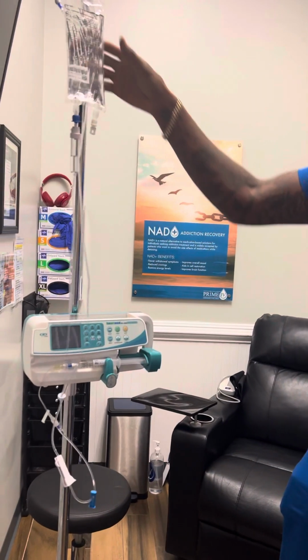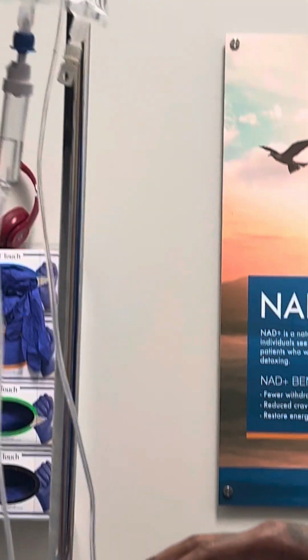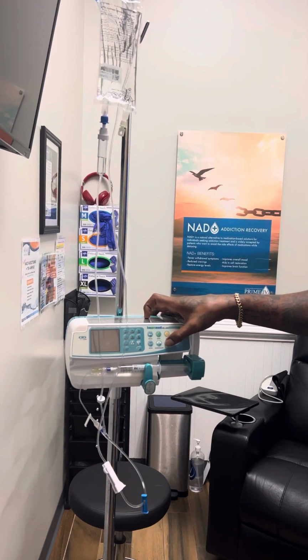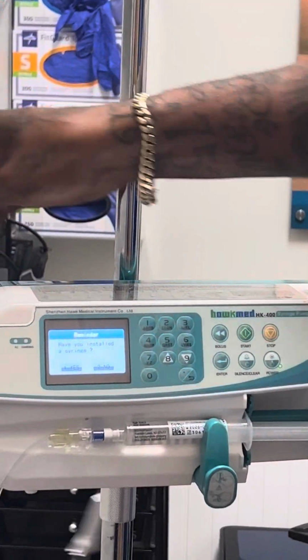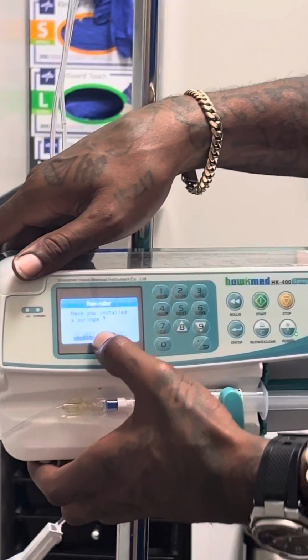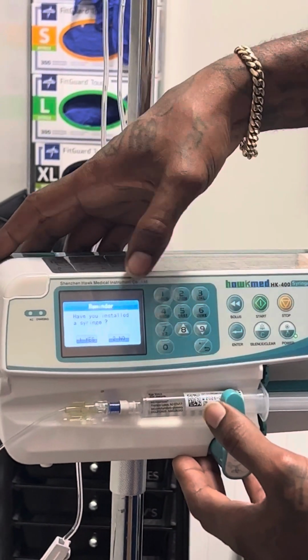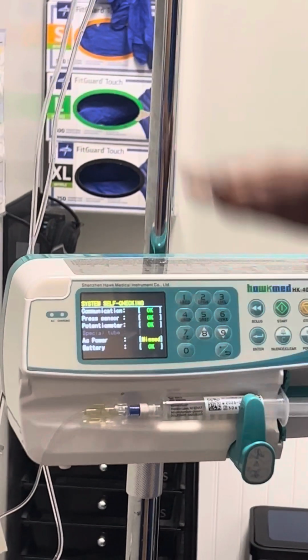But basically, this is going to be for anything outside of the 3 recommended in the bag and everything else that has to go in the syringe. But you'll see your basic power button here. Just tap it, hold it for a second. It's going to ask you this every time: have you installed the syringe? If you have, just put yes, but we're going to go through how to install a syringe. It's very easy. So I'm going to just put yes. All right, it's going to go through a self-check. You don't have to do anything during this part.